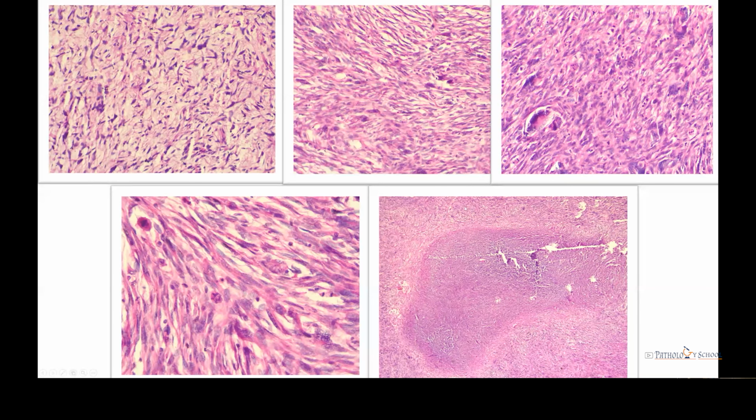Recapitulating the case, we had this tumor with both hypocellular and hypercellular areas. The hypercellular areas were predominant as compared to the hypocellular areas. And this slide which we have provided was the only slide showing some myxoid change. Otherwise, there was very little myxoid change, and it was predominantly hypercellular. We have these tumor cells which were very pleomorphic, with long fascicular arrangement at places. In the hypocellular areas, a storiform pattern could also be identified, along with pleomorphism, tumor giant cells, mitotic figures, and necrosis.